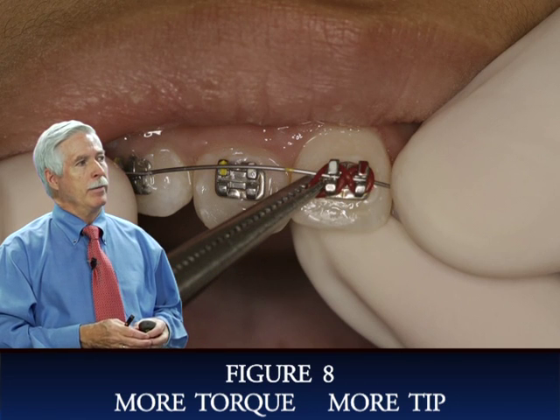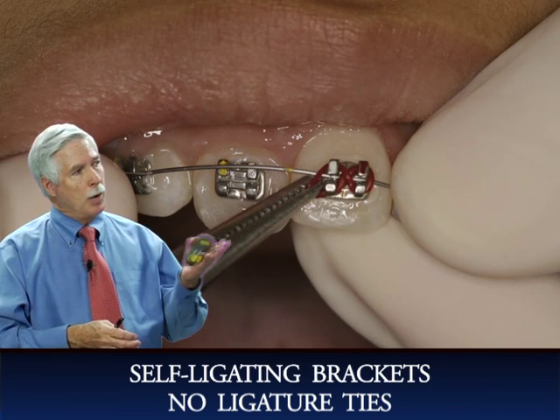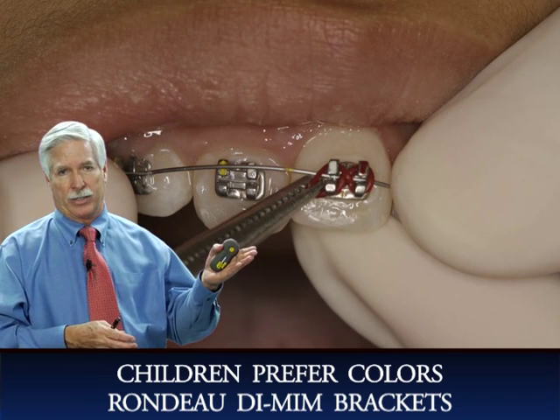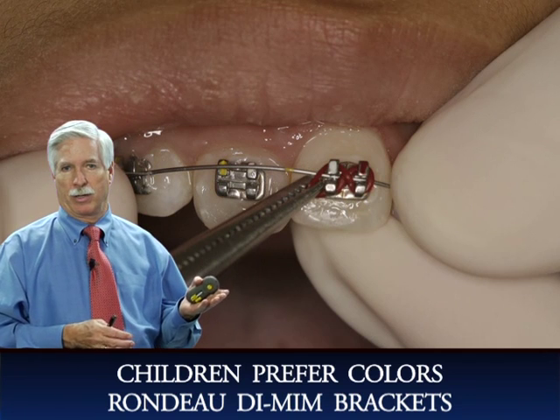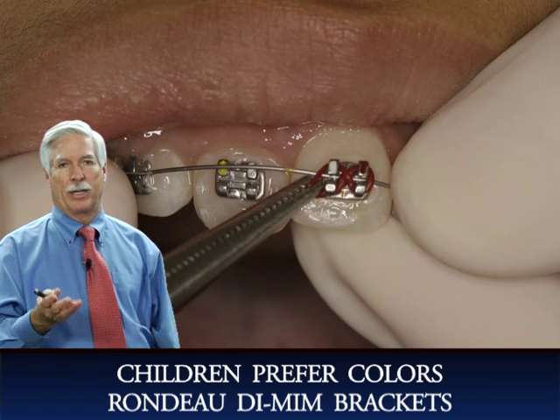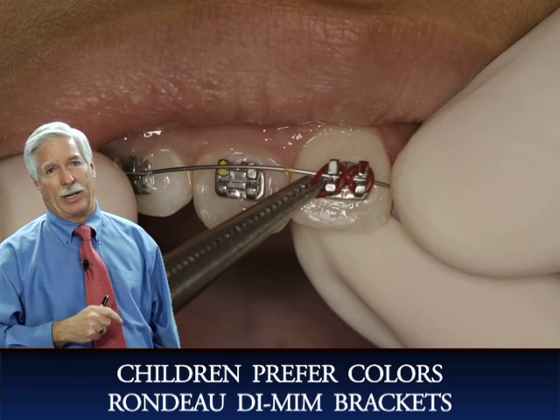Okay? One of the latest things in orthodontics is self-ligating brackets that don't have any of the ligature ties. The problem is that children really want the colors, and they really ask for these colors. And that's the most fun for them because every month they get a different color. So for the children, I usually just offer this because they want the colors and they still move fairly quickly. You'll see this case corrected fairly quickly, and they're not self-ligating brackets.